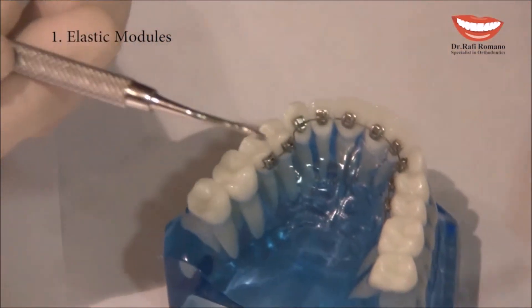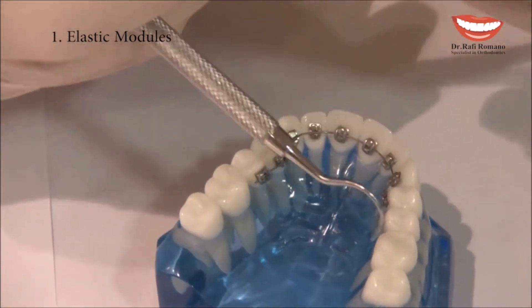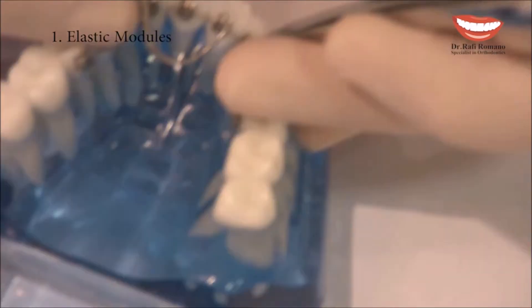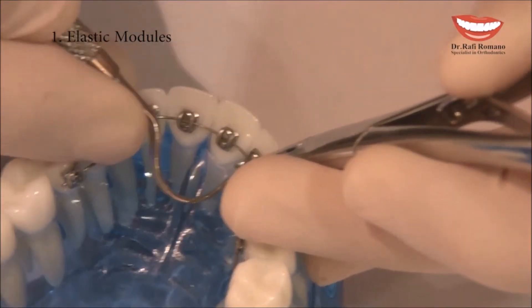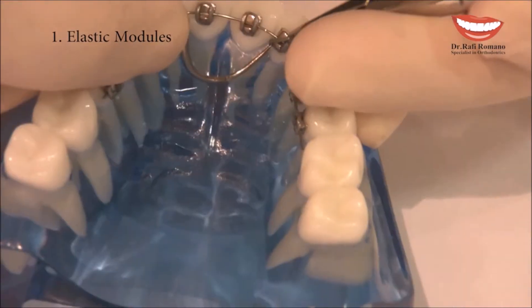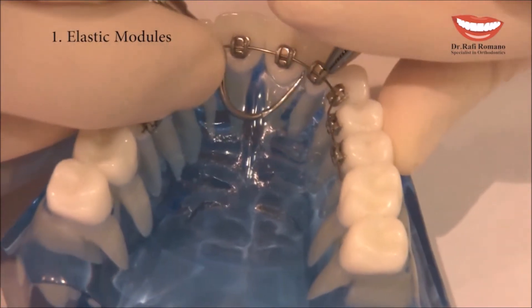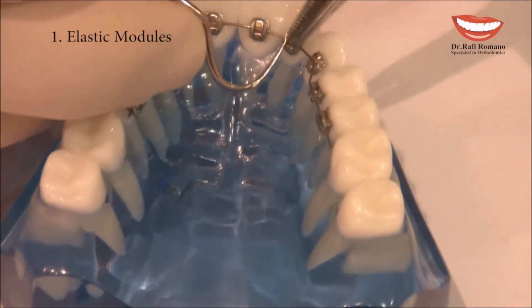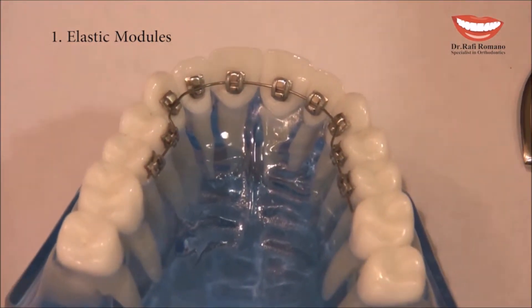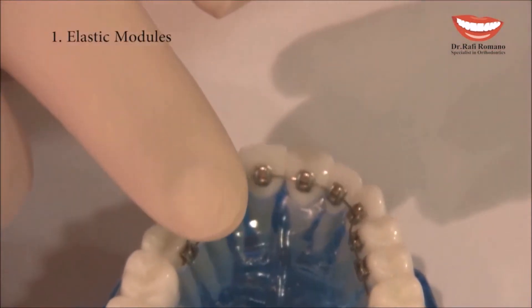The second tool is an explorer with a round tip, which gives more access to the lingual side. I guide the elastic module with it and then put it under the wing and then above the upper wing — very simple, very easy, and very useful.